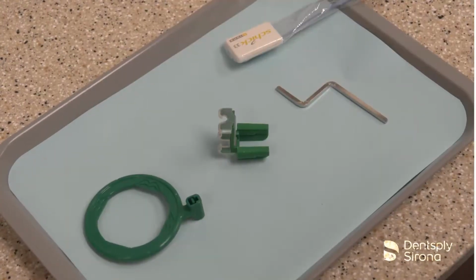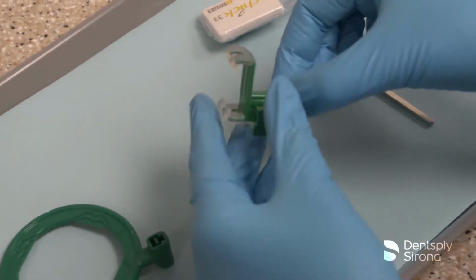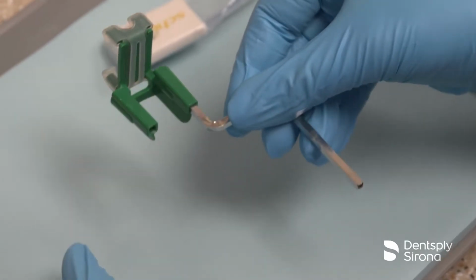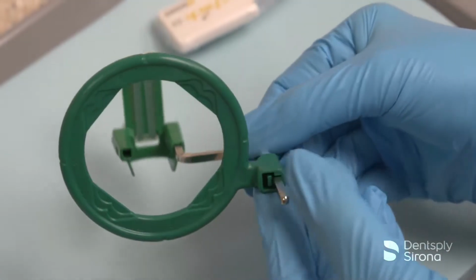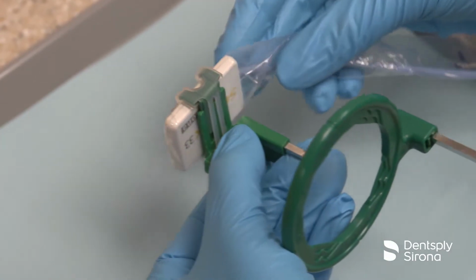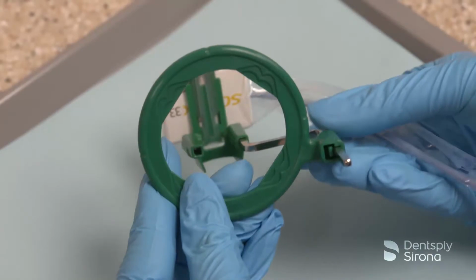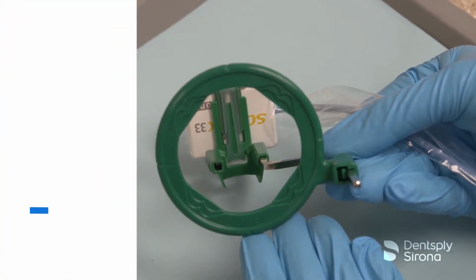To assemble the XCP Short Arm with the XCP DS Fit Endo Bite Block for endodontic images, place the metal arm into the front tab of the green bite block. Slide the arm into the green aiming ring. After placing the sensor into a RINN digital sensor cover, securely insert the sensor horizontally into the green bite block, making sure the active side of the sensor is against the flat surface of the bite block. Ensure that the image receptor is visible through the green aiming ring.